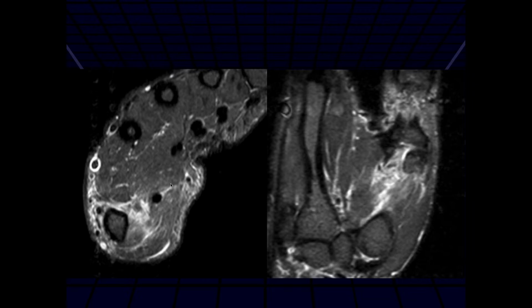So I'm seeing quite a bit of edema in the thenar muscles. So I'll see at least a grade 1 strain of these muscles. Yeah. So that's a grade 1 strain of the thenar muscle. Good.